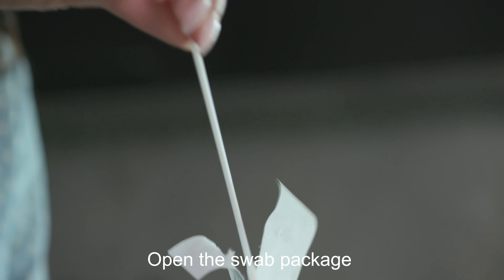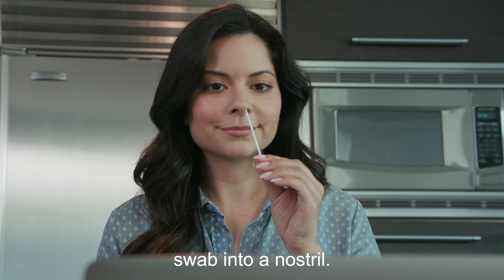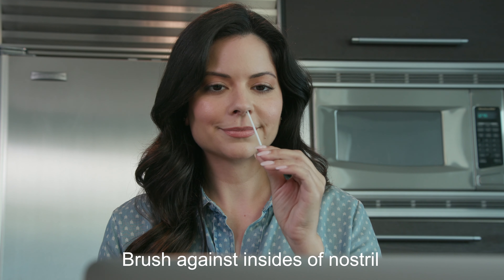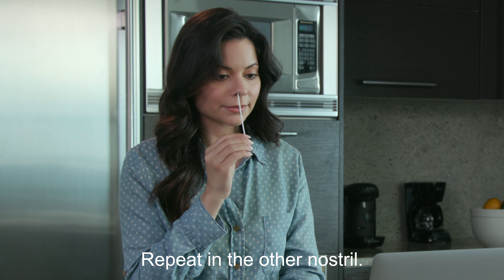Open the swab package and take the swab out. Insert the absorbent tip of the swab into a nostril and brush against the insides of the nostril in a circular motion five times. Repeat in the other nostril.